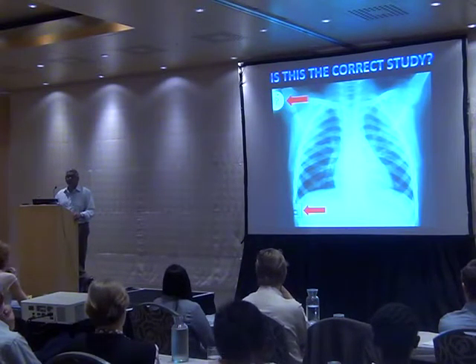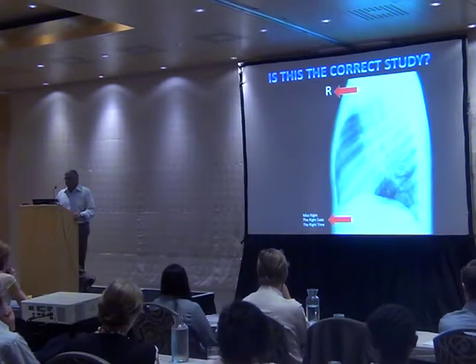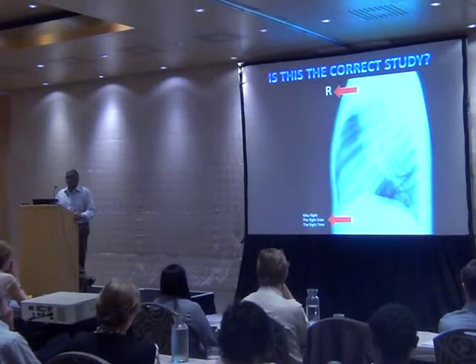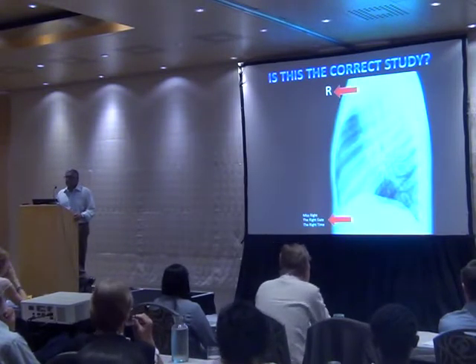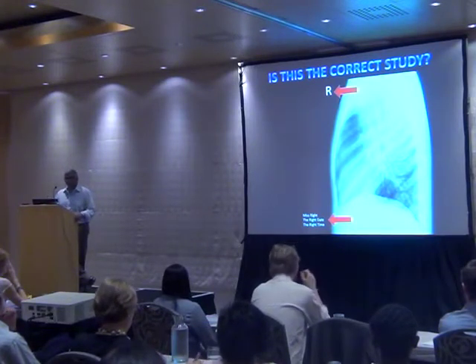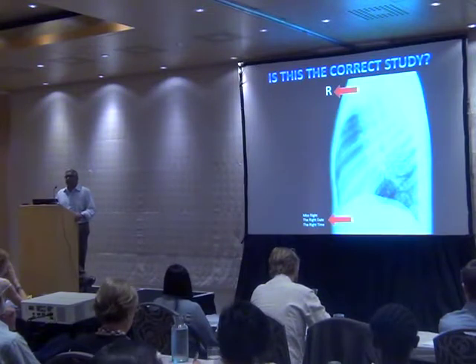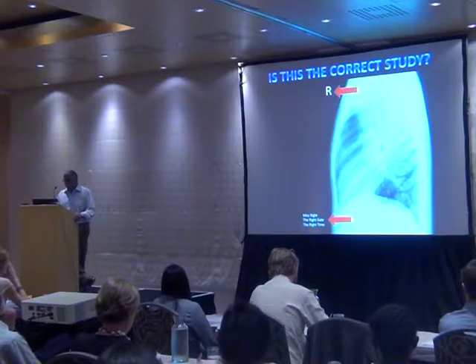Sometimes in ICU we do three or four studies in one day, so make sure you're looking at the correct time. The identification process applies obviously to the lateral projection in exactly the same way. The lead letter on the lateral projection indicates which side is closest to the detector, and this influences issues around magnification when interpreting which hemidiaphragm is which.